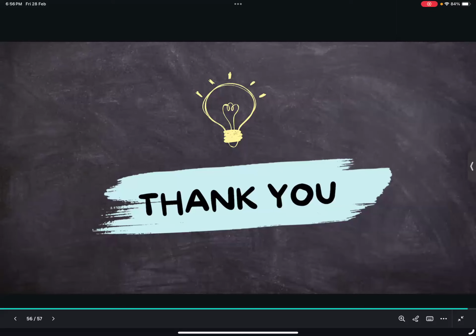Yes, I think so. Wonderful colposcopy pictures, very crisp pictures, and very nice presentations, emphasizing the basic points of colposcopy. And I would like to add to Dr. Dipanvita's comment about the routine of colposcopy: the Colposcopy Atlas, which is on the IARC website, is a wonderful resource. It has excellent pictures, and I think all postgraduates will benefit from going through the Atlas as well.